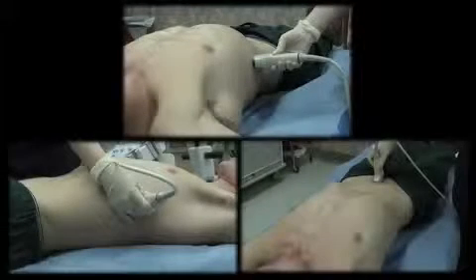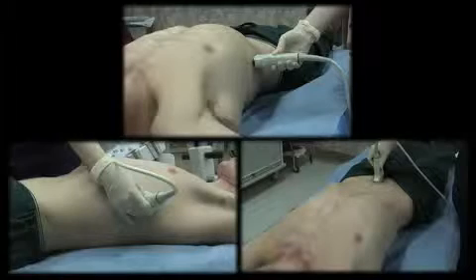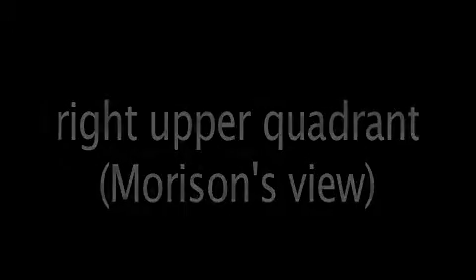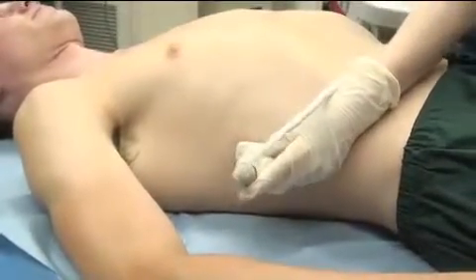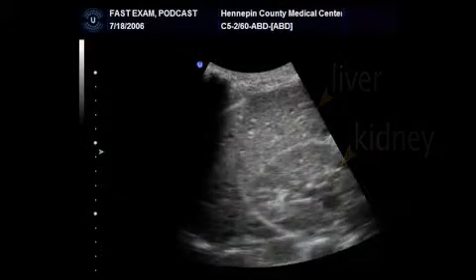To simplify our FAST exams, we keep the probe marker pointed towards the patient's head for all abdominal views. The easiest abdominal view to obtain is the right upper quadrant, often referred to as Morison's view. The probe is placed in the mid-axillary line at about the 7th to 11th rib interspace. This view will demonstrate the liver, kidney, and right diaphragm.